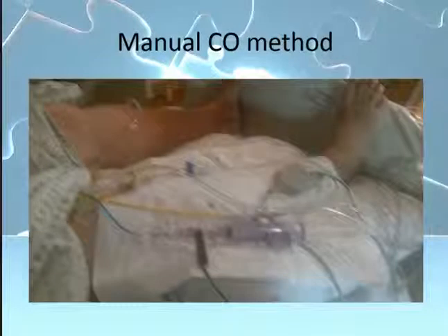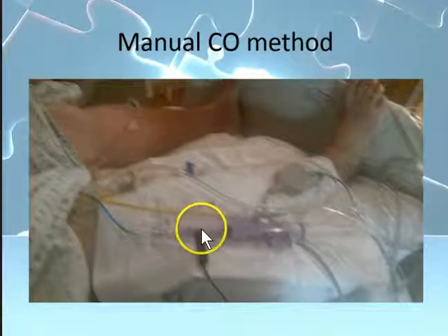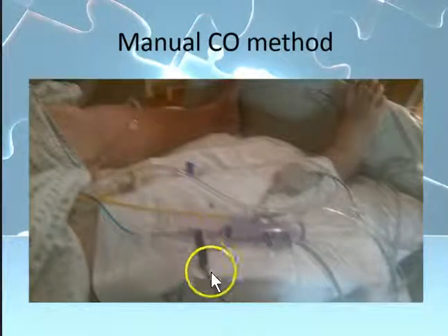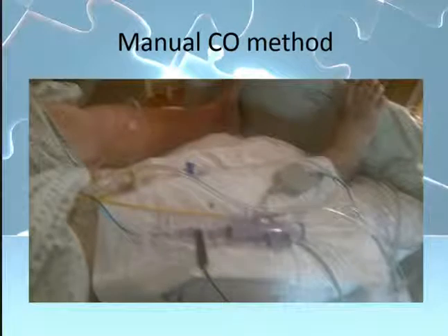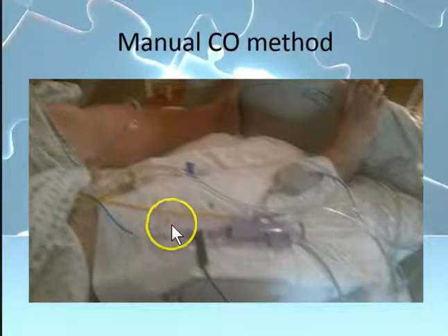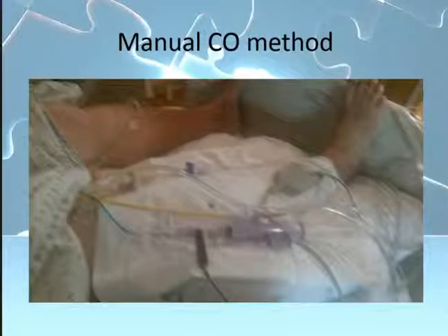So this is, again, you see that the syringe is attached to your blue port there, your Proximal Injectate, and then you can see where the temperature is hooked into the manual Swan. It will give you temperatures as well, but it does have to have extra equipment for that.